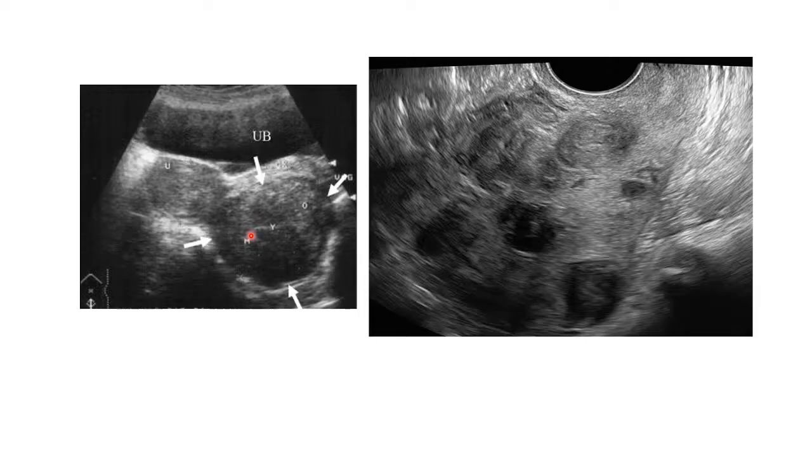These ones mostly cause excruciating pain. Why? Because at the stalk here, they can twist, because there's a small narrow stalk that connects the two. The uterus is also mobile, and so are the intestines and all that. So this thing can move and twist. When it happens, you can have excruciating pain from a pedunculated fibroid.